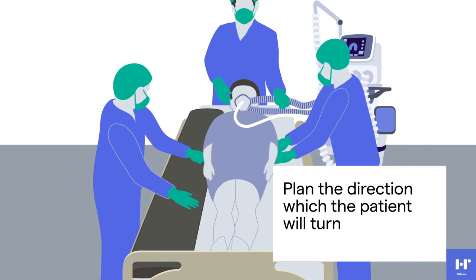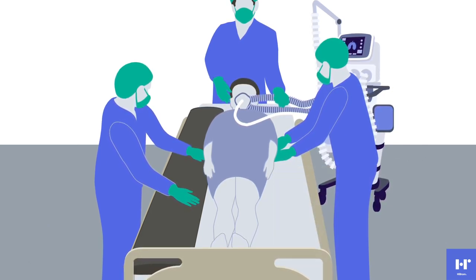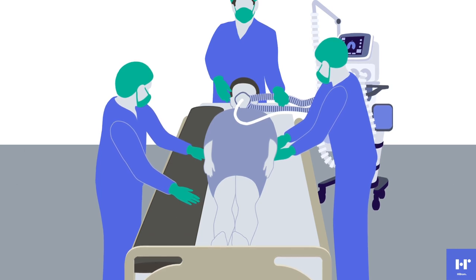Adjust equipment, attached tubing, leads, and lines so there is enough slack during the movement. In this example, we show turning the patient onto their left side into prone. The direction to turn the patient is at the discretion of the care team.